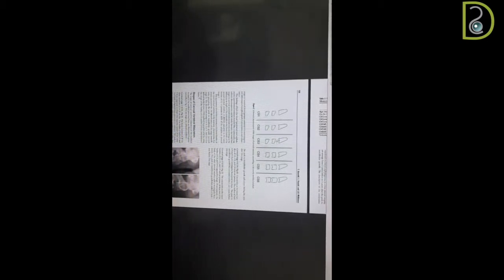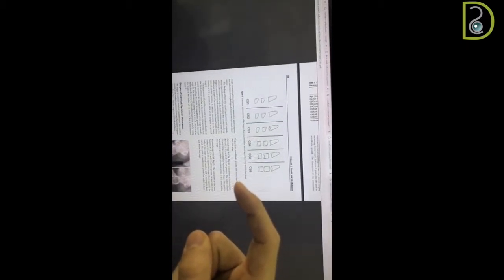Stage number 2, when the second vertebra has concavity here, while the third and fourth still have a straight line. So at this stage, I tell the patient, well, it's too early, but I can see you after 1 year. So here is 2 years, here is 1 year before the growth spurt. Here, this is the start of the growth spurt, when the second and third vertebrae have concavity. You see the concavity? It was flat, then it became like that, okay? This is the best time to start the growth modification for class 2 cases.